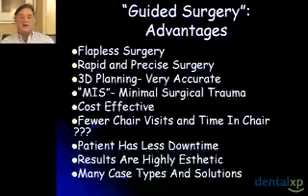If, on the other hand, you're doing a provisional, they would probably have the same amount of chair time, but maybe fewer or the same number of visits. The patient personally has less downtime. The results can be highly aesthetic, as you saw from some of our restorations, even at the provisional steps, and we're able to do a lot of different steps.